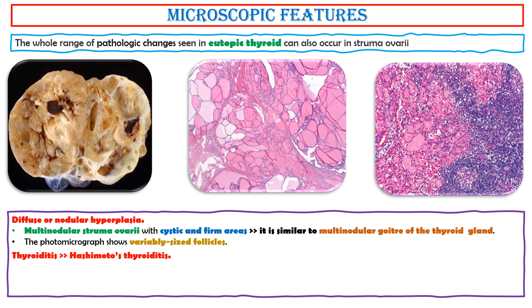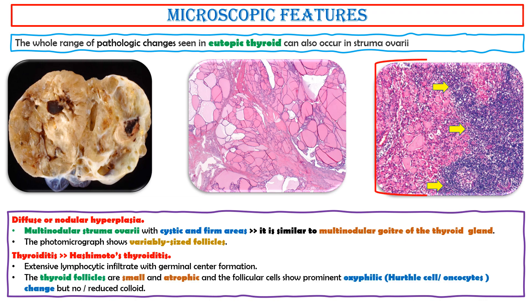Thyroiditis — Hashimoto's thyroiditis. This photo shows extensive lymphocytic infiltrate with germinal center formation. The thyroid follicles are small and atrophic, and the follicular cells show prominence of the oxyphilic Hurthle cell / oncocytic change, but no or reduced colloid.